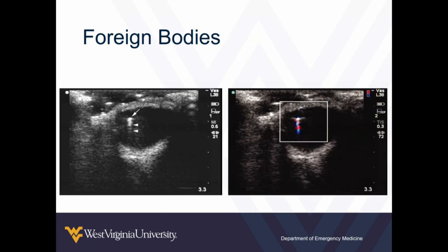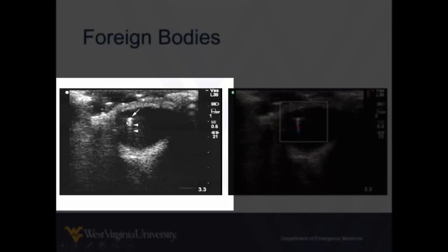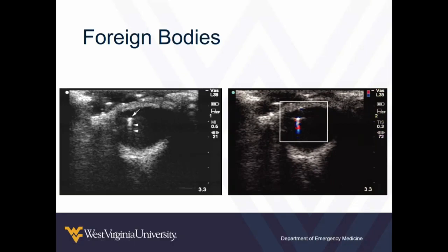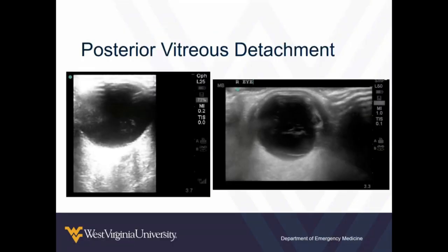Some other posterior problems are foreign bodies. Now, if you thought a foreign body was really there, maybe you shouldn't have stuck the probe on there, because this is going to penetrate the globe — a ruptured globe. But here's an example of an ocular foreign body. Like kidney stones and other things, you put color on them and they get this little twinkle artifact, which is interesting. Those are easy to find — maybe you shouldn't have found it, but they're cool to look at.